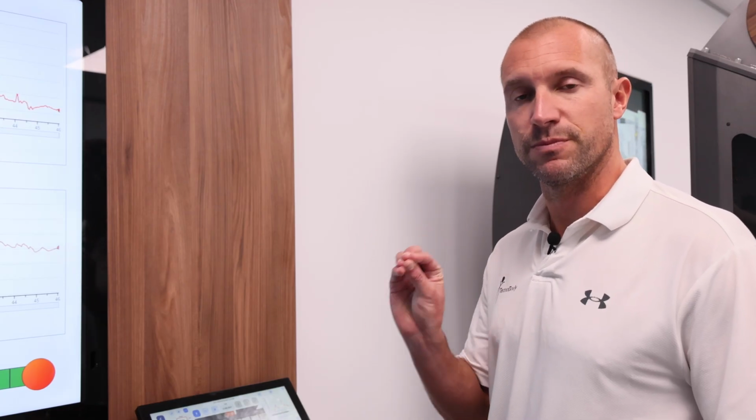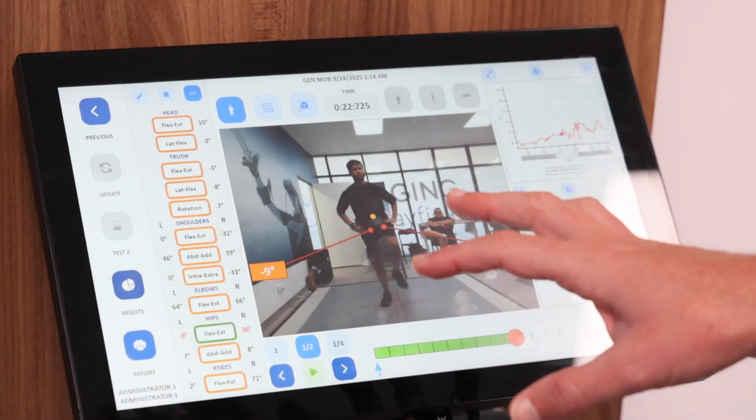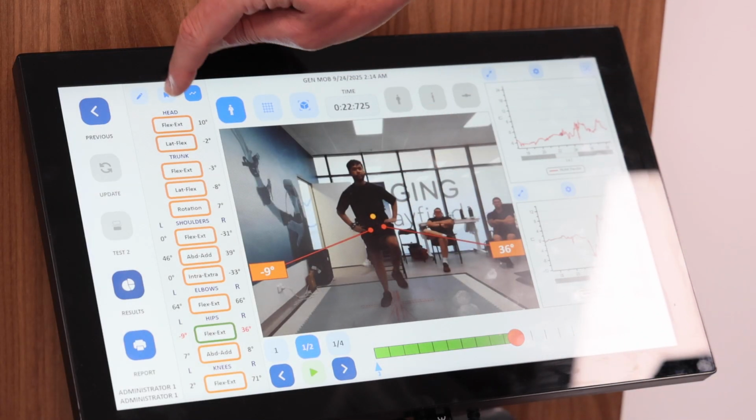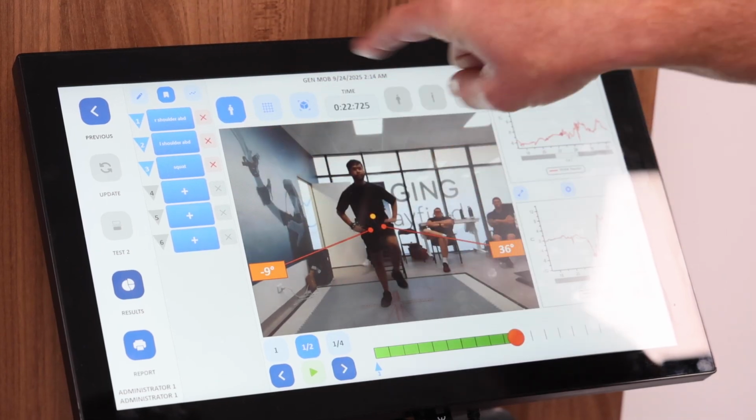After completing the motion analysis, we have even the opportunity to create a PDF report, just selecting 6 bookmarks, so 6 frames inside the video. This will generate a PDF and then we can download it onto our USB key. To create the PDF report, just click on the second button at the top. You have the opportunity to select 6 pictures inside the video.